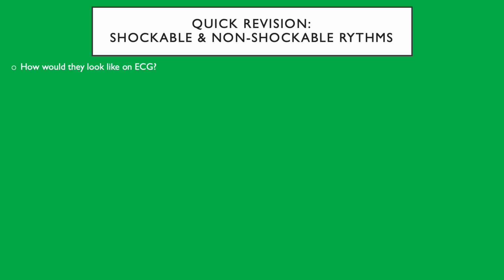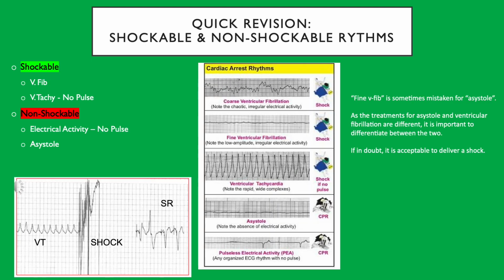Pulseless electrical activity is non-shockable. Yeah, you're right. So this is what you said. So shockable is ventricular fibrillation and pulseless ventricular tachycardia, okay? And non-shockable, that you don't shock, is asystole and pulseless electrical activity, okay?